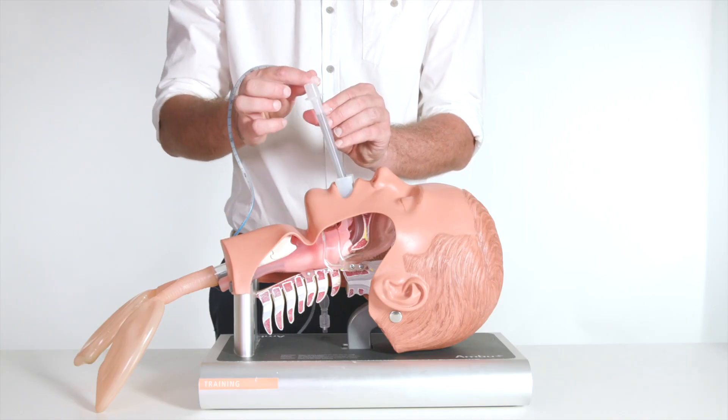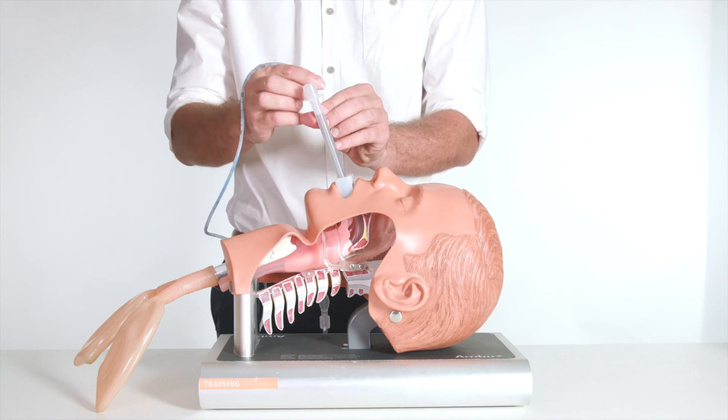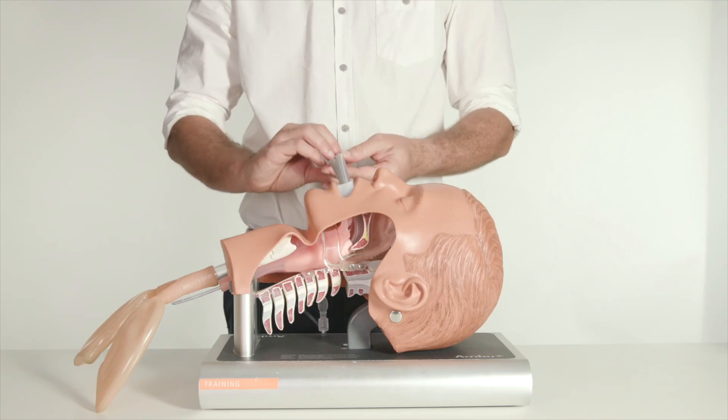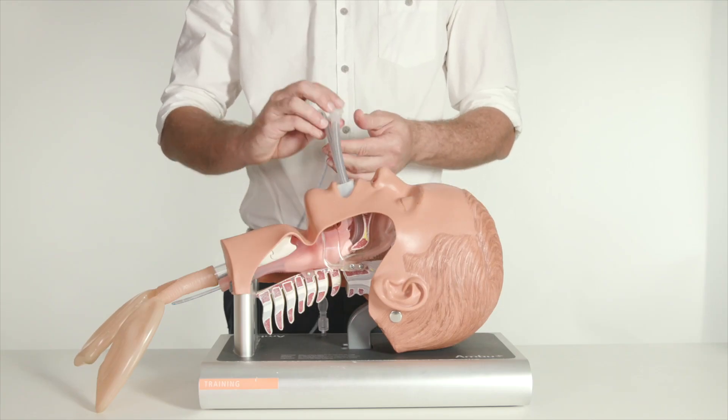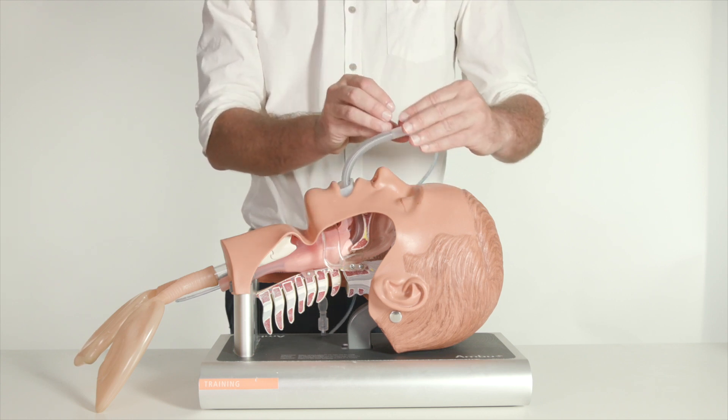In this case we will insert a nasogastric tube to confirm placement and check that patient ventilation is adequate. The Genesis Flexi 2G SAD is particularly useful in procedures where the surgeon and anesthesiologist are working in the same area, such as procedures involving the mouth, head, or neck.